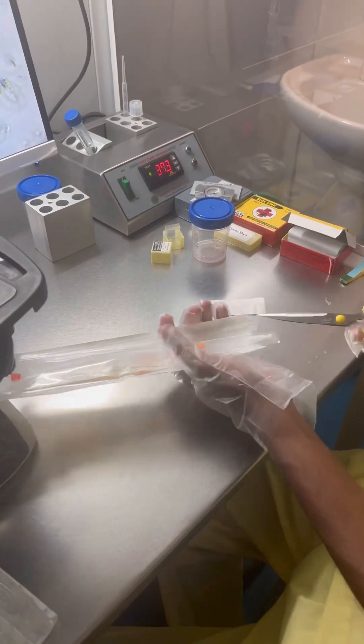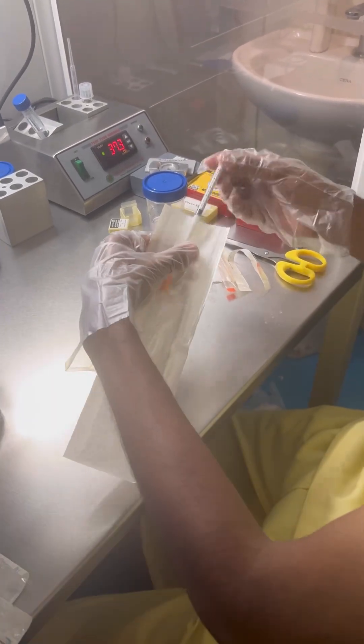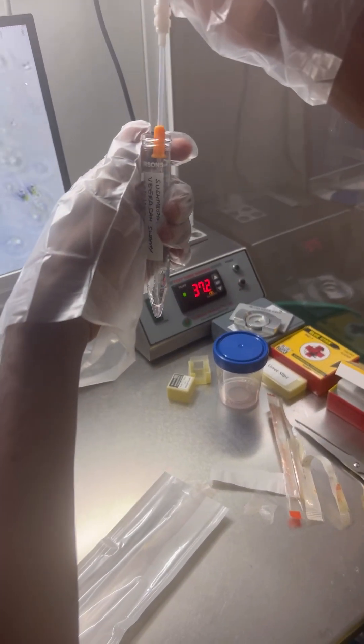Once we finish processing, we check the count. Then we take the IUI catheter and load the sample inside it.